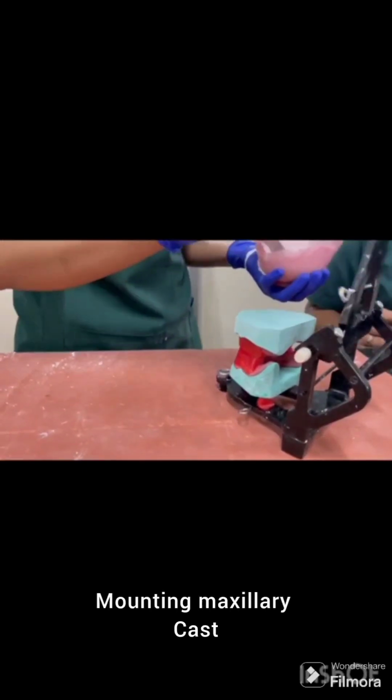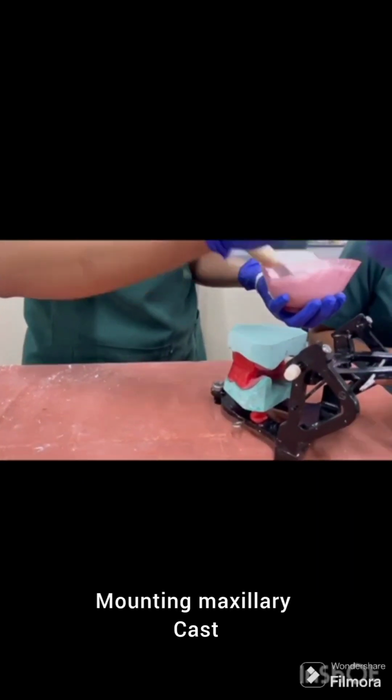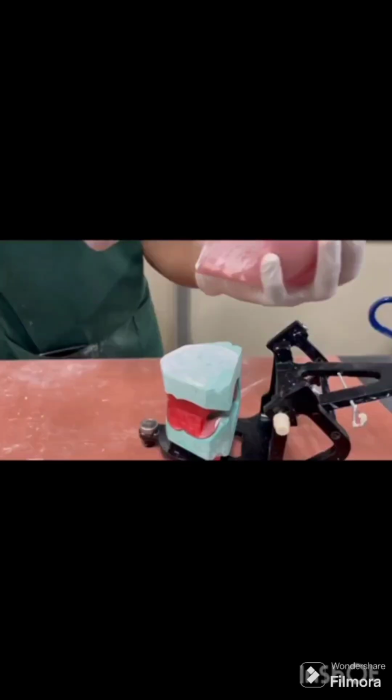Plaster is mixed and placed over the cast, and the upper member is then gently closed till the incisal pin touches the incisal table, and then the excess is removed.